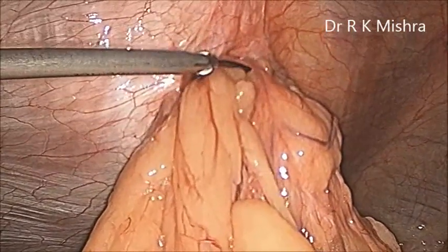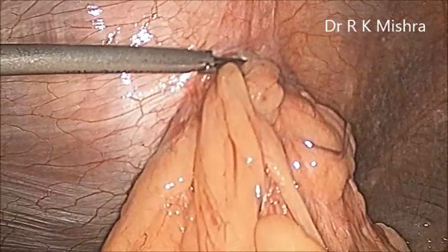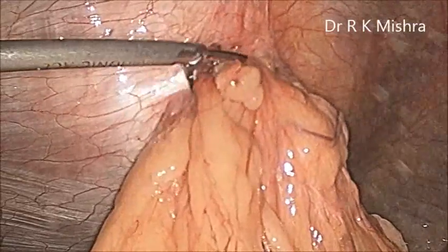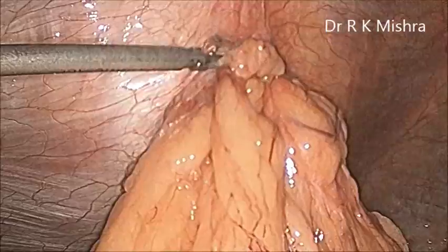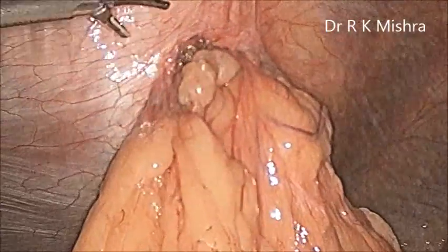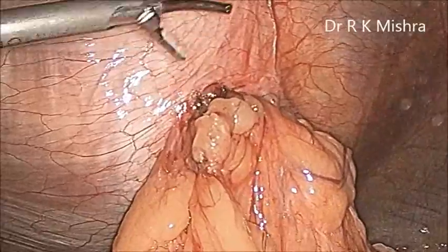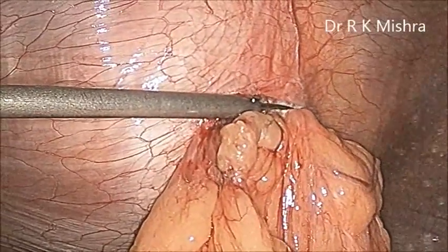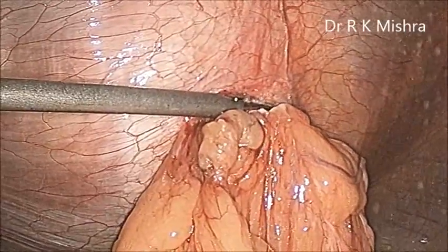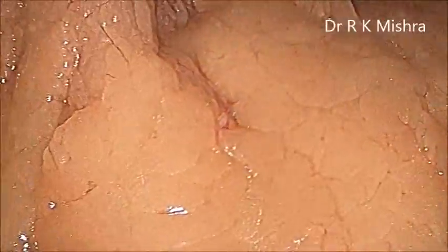Here we are putting one big gauze piece above and pressing it so that all the content is reduced down. Now this is the harmonic through which we are doing adhesiolysis. This patient had only omentum as content inside — no bowel was there. With a huge ball of gauze piece, if you press it down, the omentum can be easily pushed in.